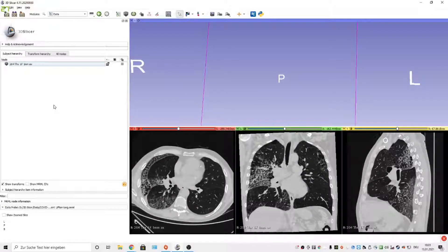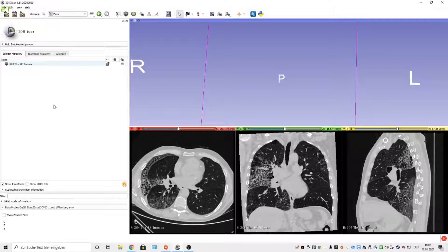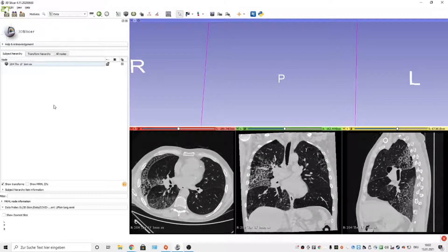Hi, I would like to show you my present workflow: how to segment trachea and airways from a lung CT scan in 3D Slicer. I'll be using Slicer's Segment Editor and the Grow from Seeds function.